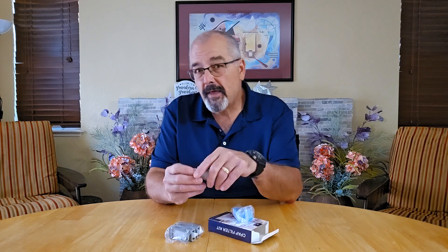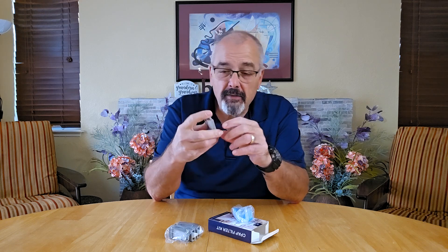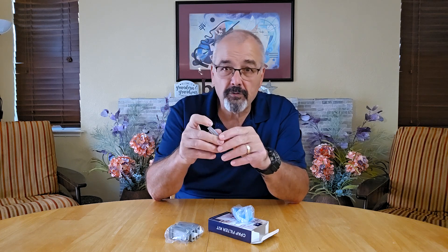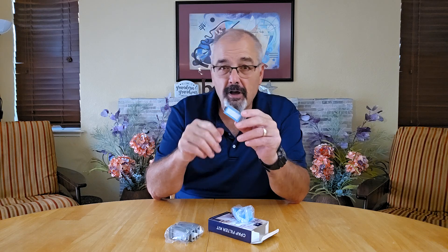You get both reusable and disposable options. The pollen filters are easy to clean, and that makes them a personal choice for regular use. The ultrafine filters are very easy to install and filter the smallest particles when you need it most. If you're looking to keep your CPAP system fresh without frequent reordering, this pack has you covered.